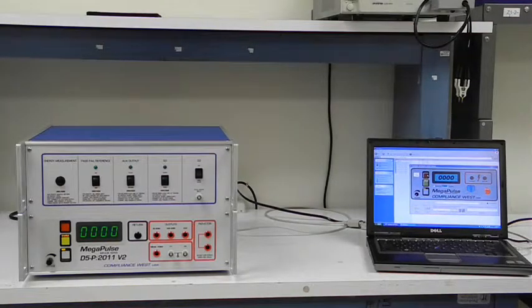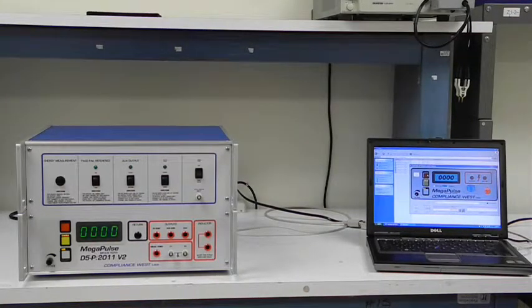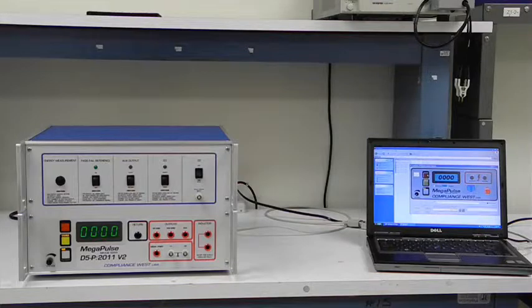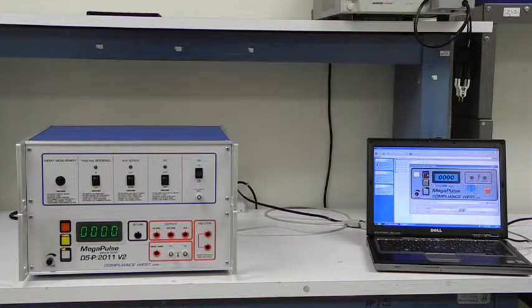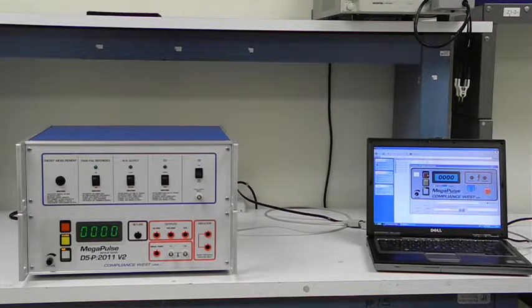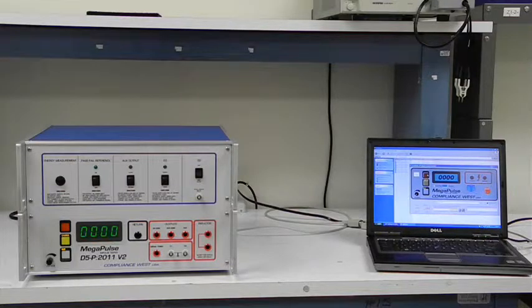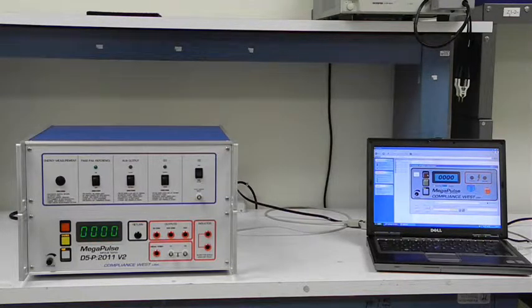In IEC 60601-1 Issue 3, the energy reduction test needs to be conducted. This test measures the energy consumed by the equipment under test.